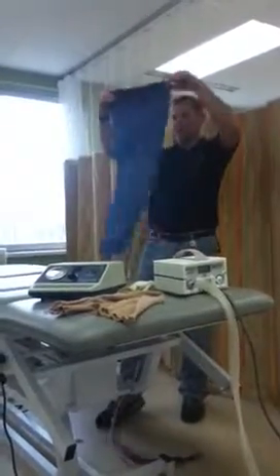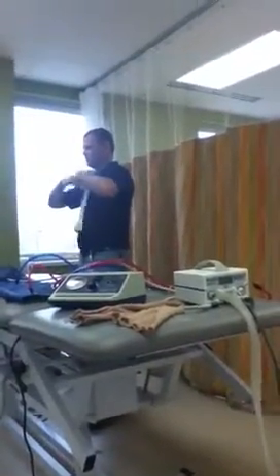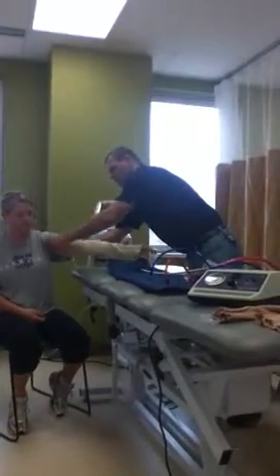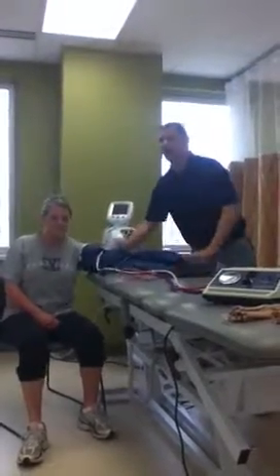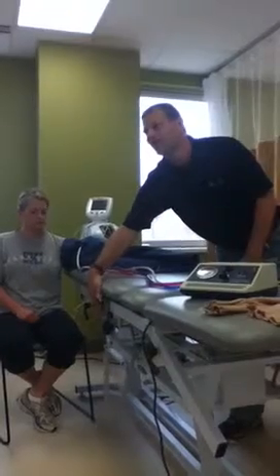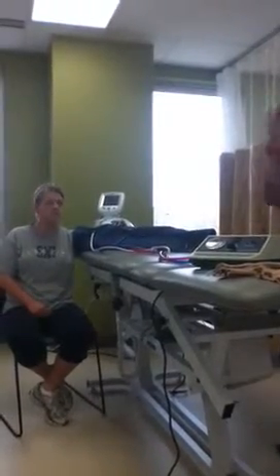So here's my machine — pretty idiot proof. I get colored wires and colored nubbies, and my colored wire goes into my colored nubby. It's conically shaped so there is a top and a bottom. I'm going to put some stockinette on there so she doesn't get sweaty inside or have to exchange sweat with the person before her. There are lots of different sizes. I want that limb above her heart to help with drainage, so if she's sitting and it's an arm, I'm going to want to raise whatever I have up.